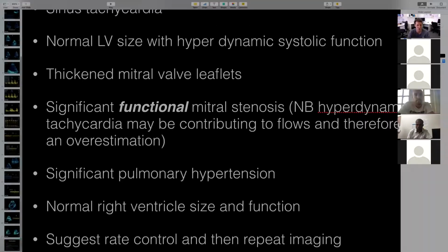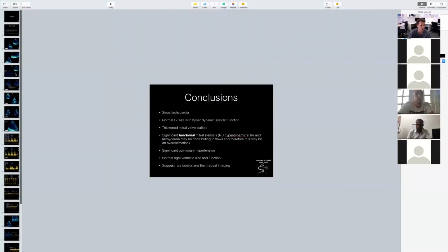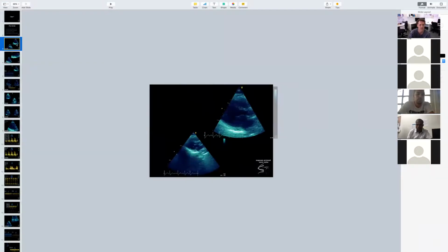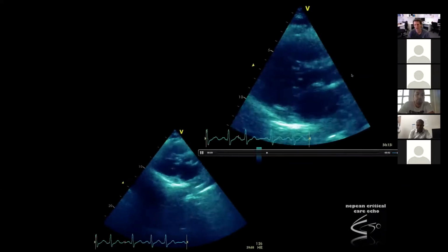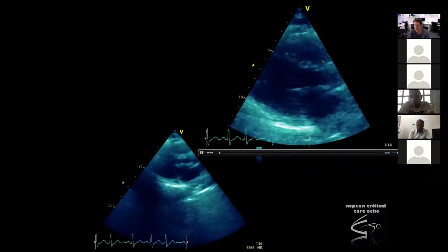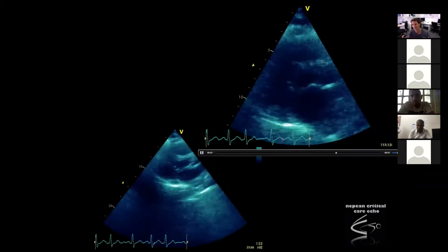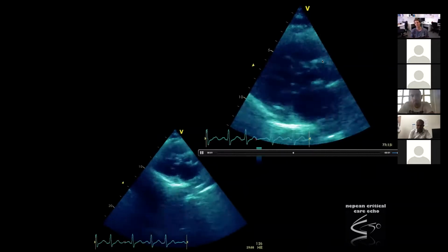I don't know if I could show that to you again. But you see her aortic valve was not normal. I measured the LVOT VTI, and I don't think that aortic valve up at the top looks normal either, which points to the idea that she's maybe got this degenerative change. It's that whole valve that's being affected. It's not rheumatic fever. I think it's degenerative changes in her heart.